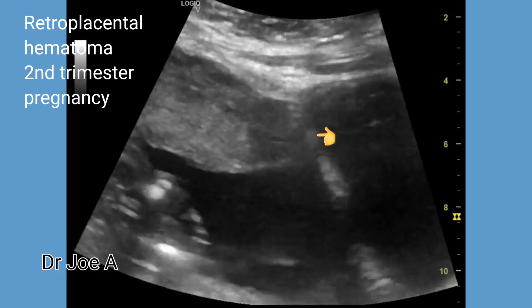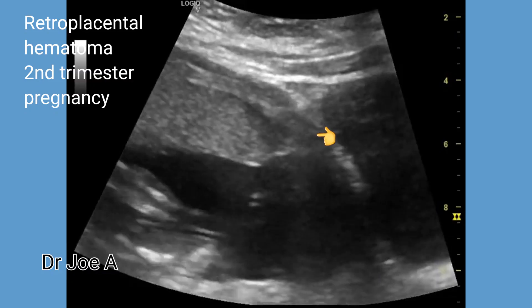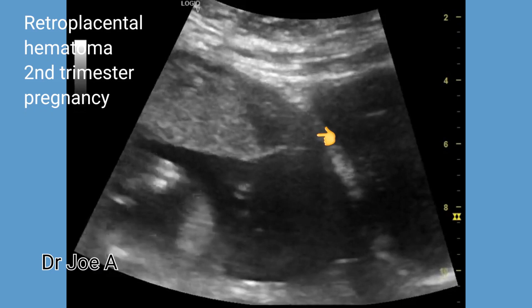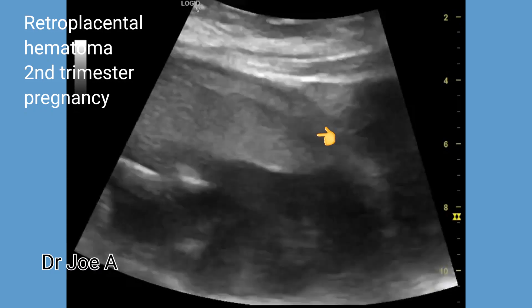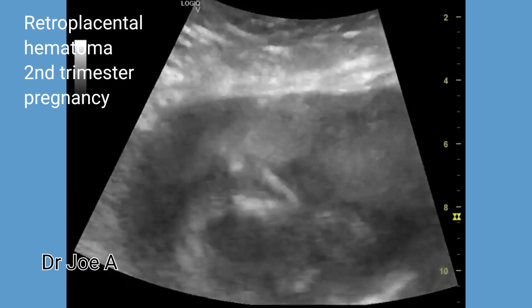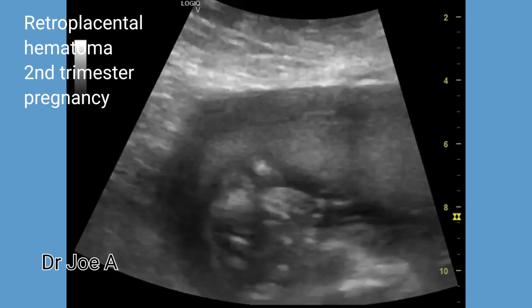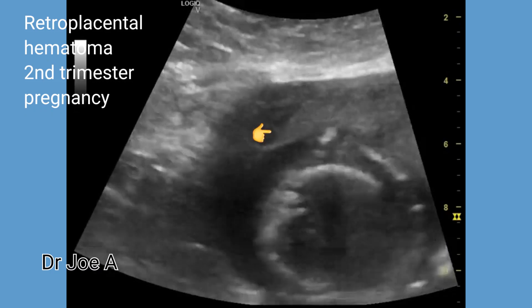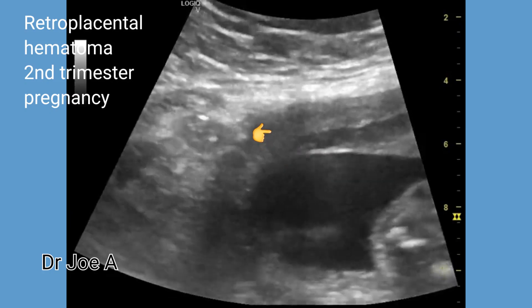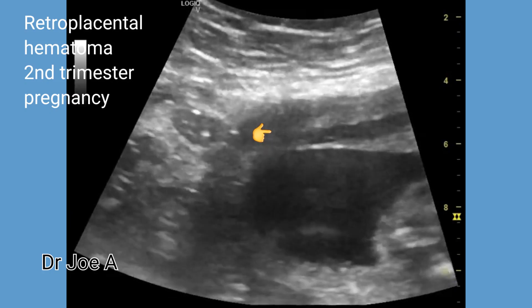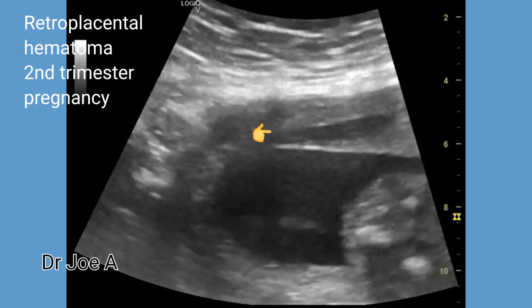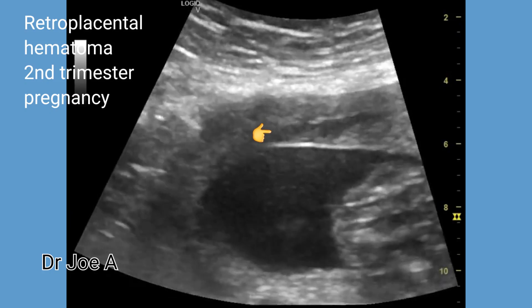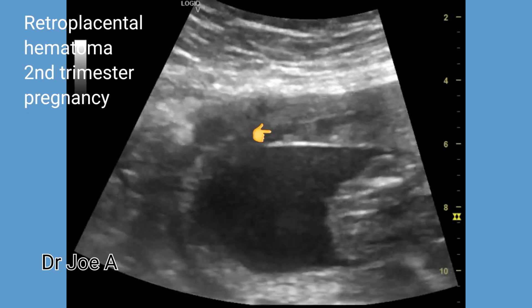There is a hypoechoic collection at the lower margin of the placenta. Thus, this patient has two retroplacental hematomas, one at the upper margin and one at the lower margin of the placenta.